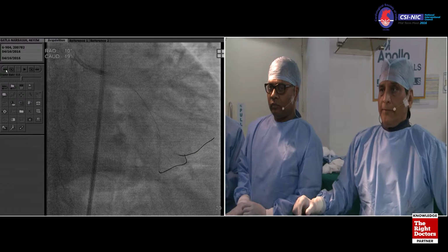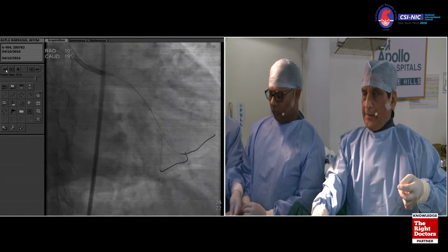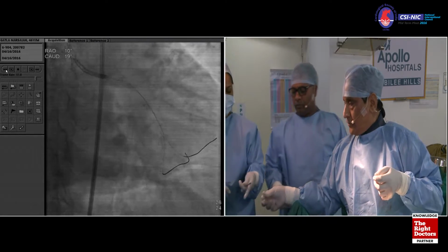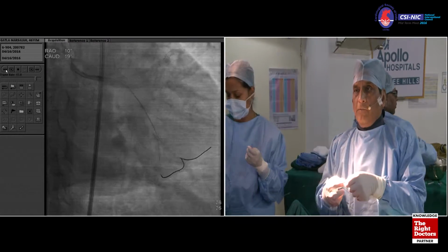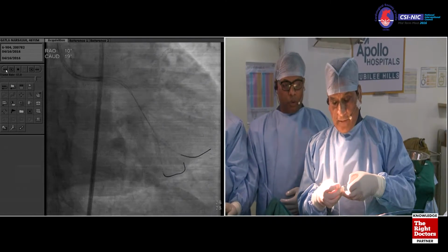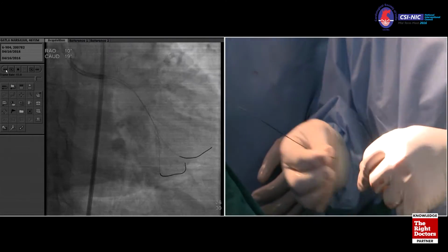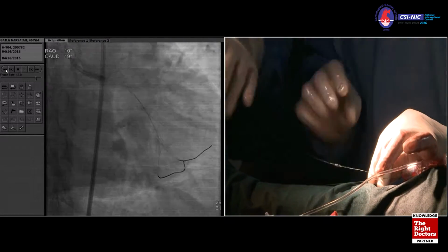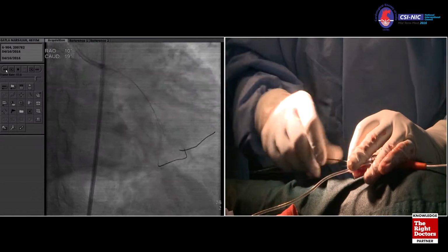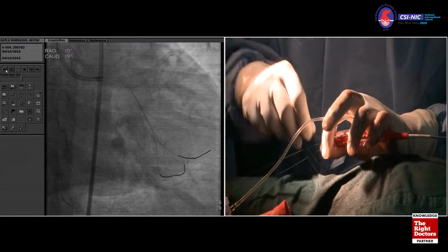So the question was that clearly when you go to the side branch, you want to go to the edge, as distal as possible, so that will give you a better ostial coverage. Right? Now what do you think here? We have gone through this distal part of the ostium, so that is what will be the teaching. And now if we have trouble going with the balloon, then of course we need to bring it out and do it again through a different strut.